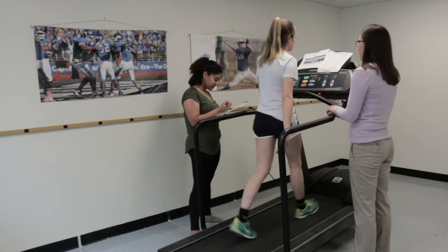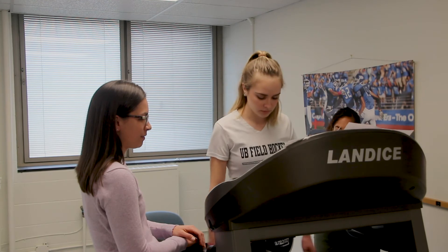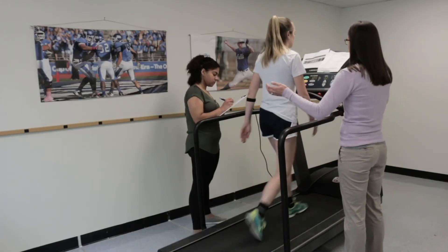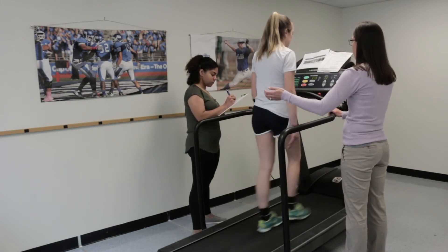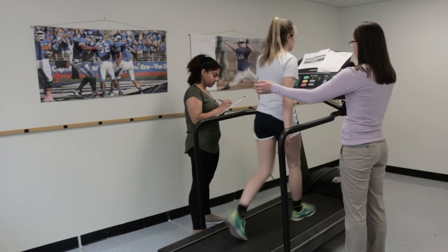One of the big advantages of using the treadmill testing is that if somebody shows exercise intolerance very early on — at a low heart rate of, let's say, 110 or 120 — it tells us that they not only have the physiologic characteristics of someone with a concussion, but they are likely to take much longer to recover. That's very helpful for us in terms of giving someone guidelines about prognosis.